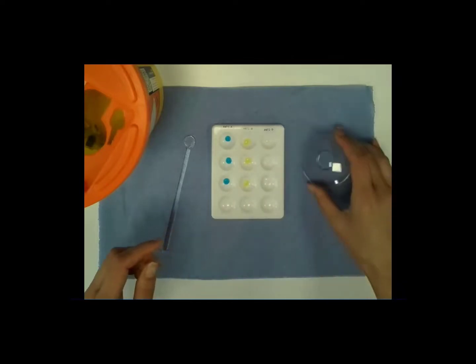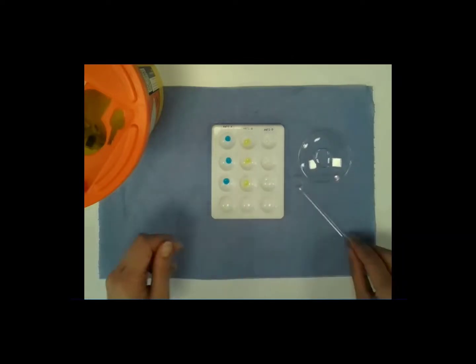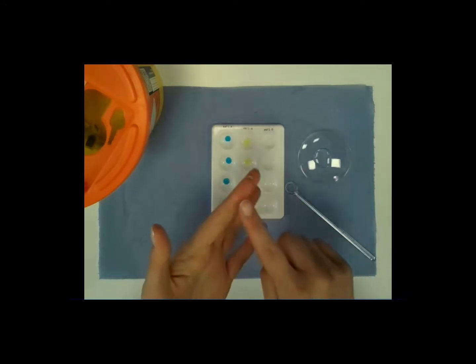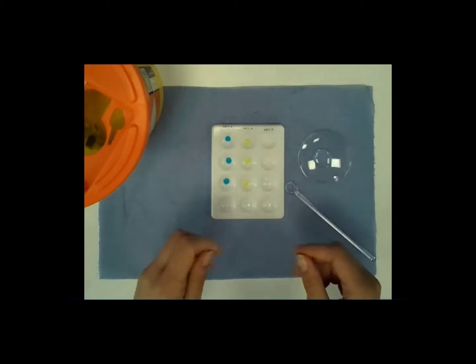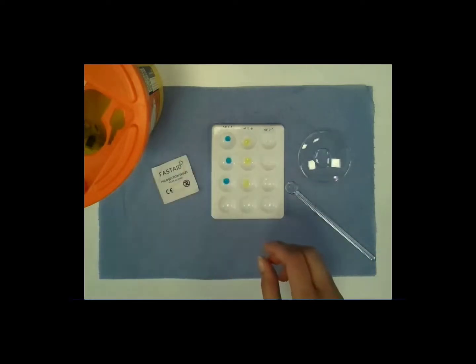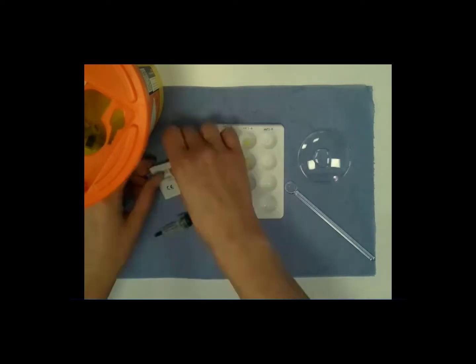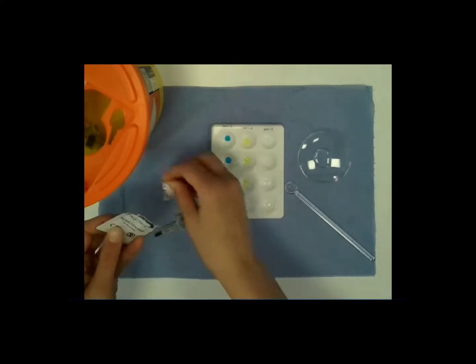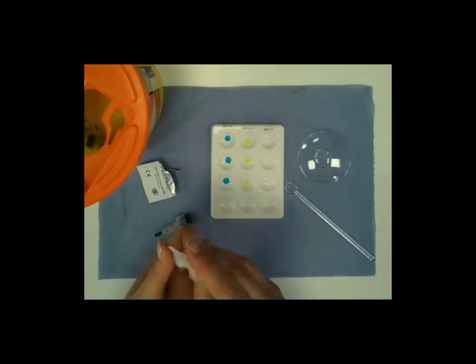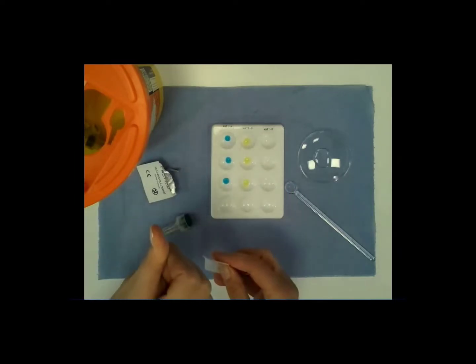Now everything's set up, we can carefully take a blood sample. Just as before, the side of the thumb or the forefinger is a good site to take the blood from. You're going to need a swab to clean the area and one of the safety lancets. Take the swab, open it, and carefully swab the area that you're going to take the blood sample from. In this case, I'm using the side of my thumb.